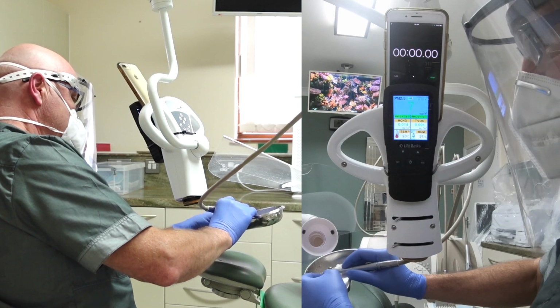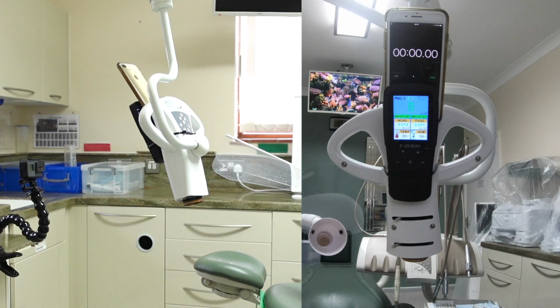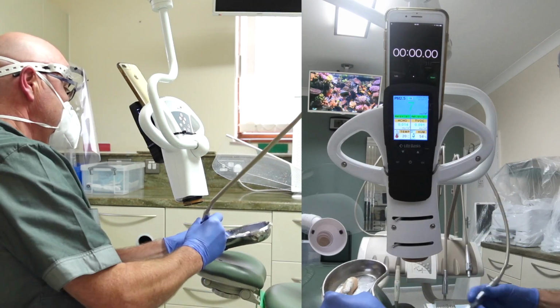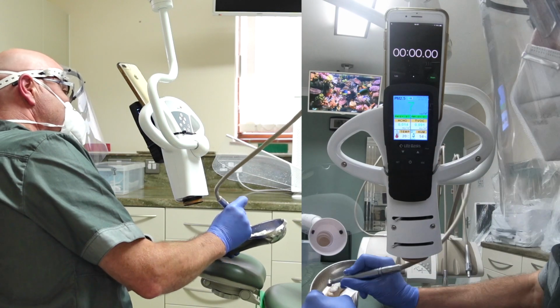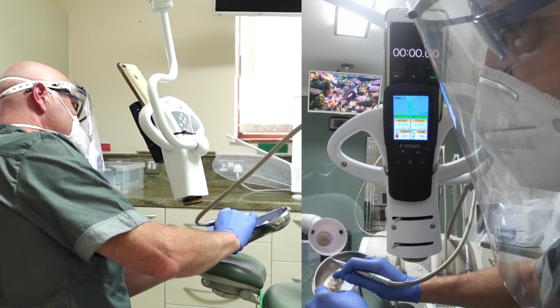I'm going to ignore water coming out here. Well, actually, I don't want to get things wet, so let's just tip that away. And we would pause occasionally, wouldn't we, to let the patient maybe have a break. Let's move some more yogurt down onto the tooth.